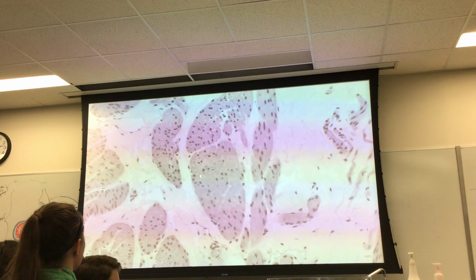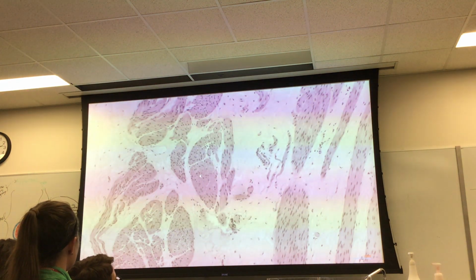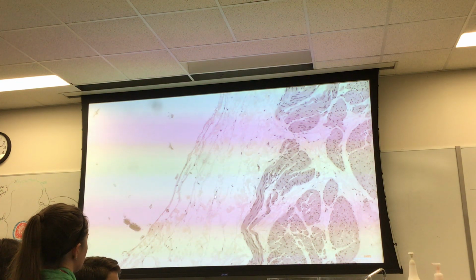This is smooth muscle cross-cut. What you're going to observe is that in this case, this is inner longitudinal, outer circular. Don't worry about this too much, but it's going to help you identify this as urinary system. So you have the epithelium, and then you have this observation. Let's drop our mag even further. Then you come back out here and it's just connective tissue.